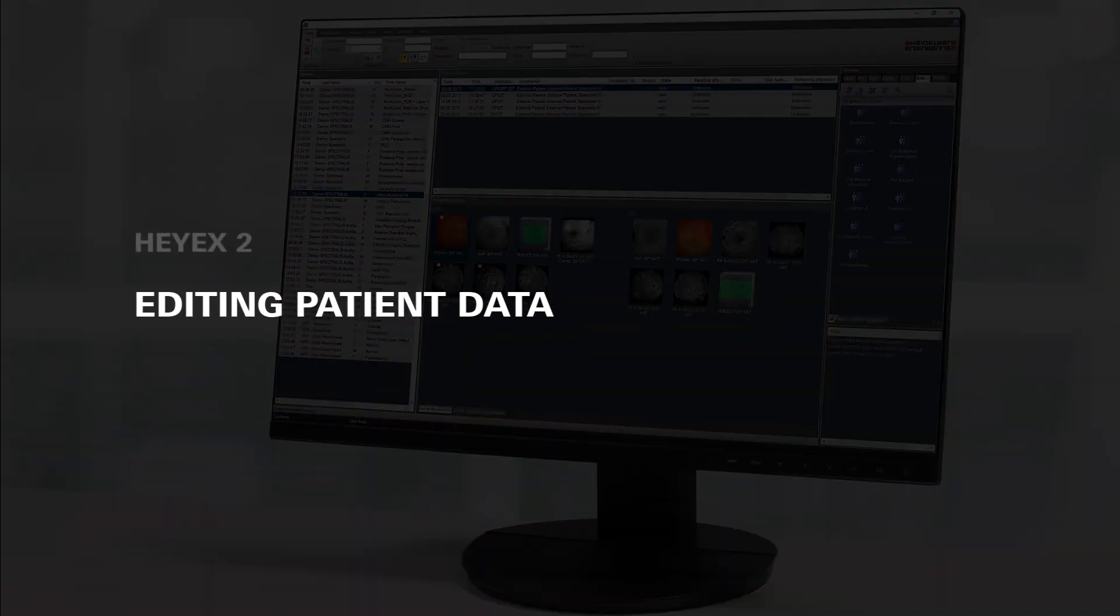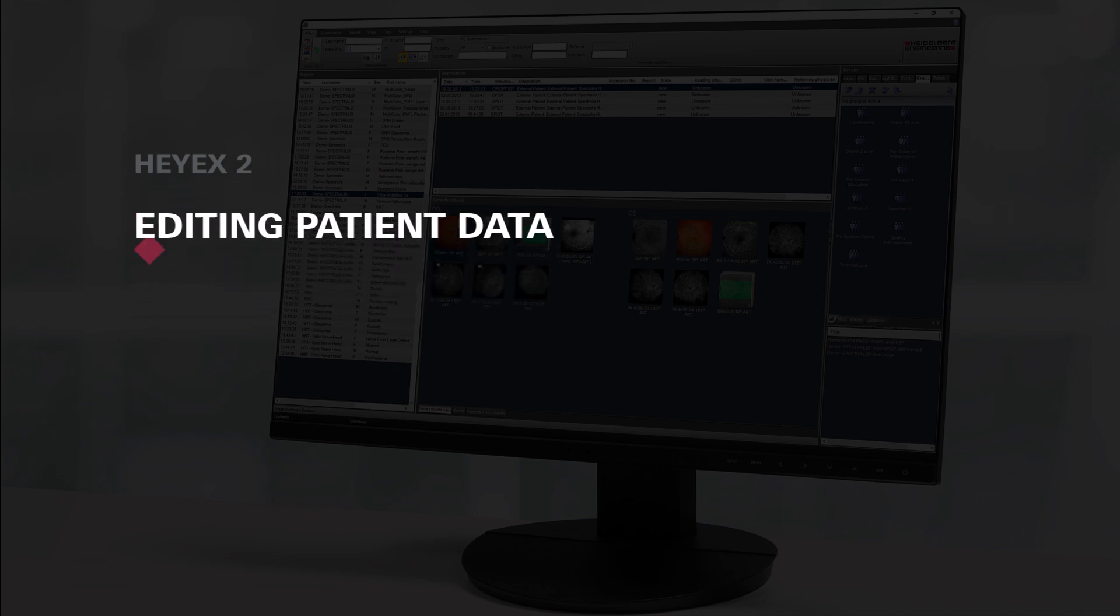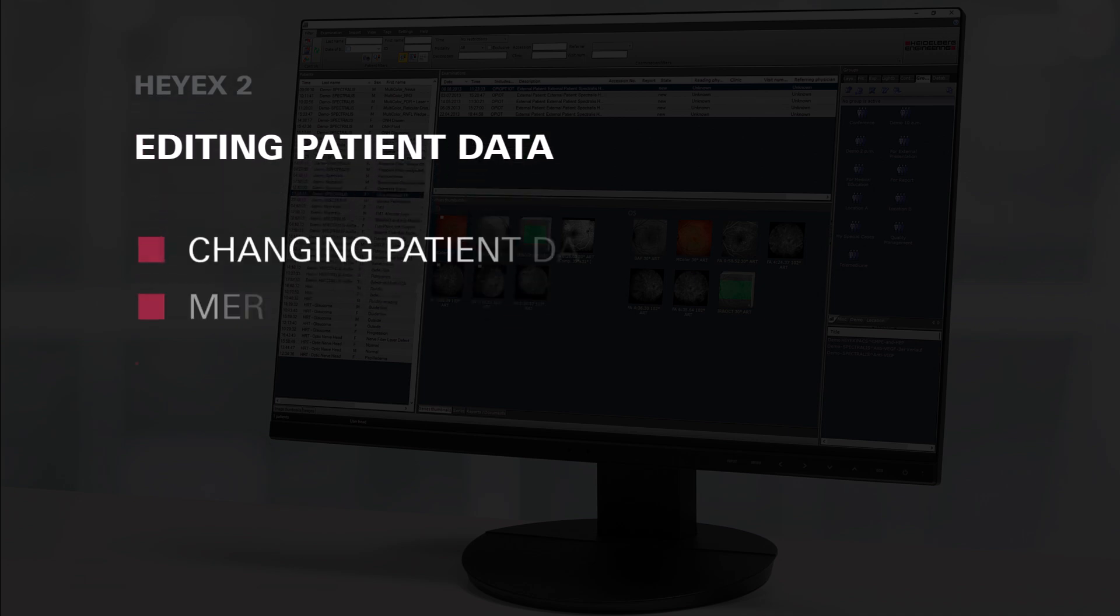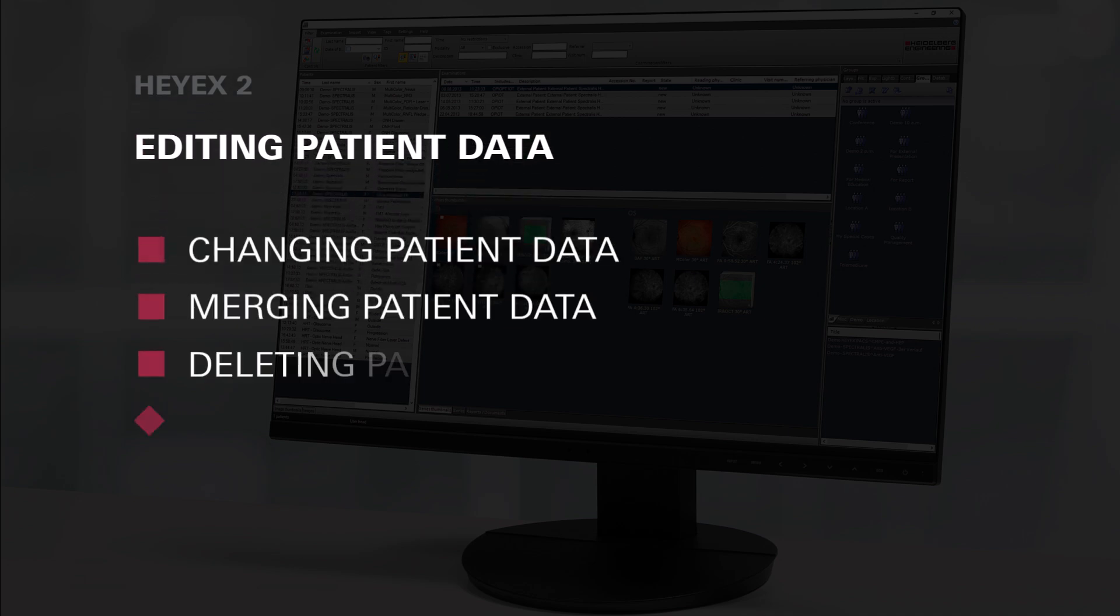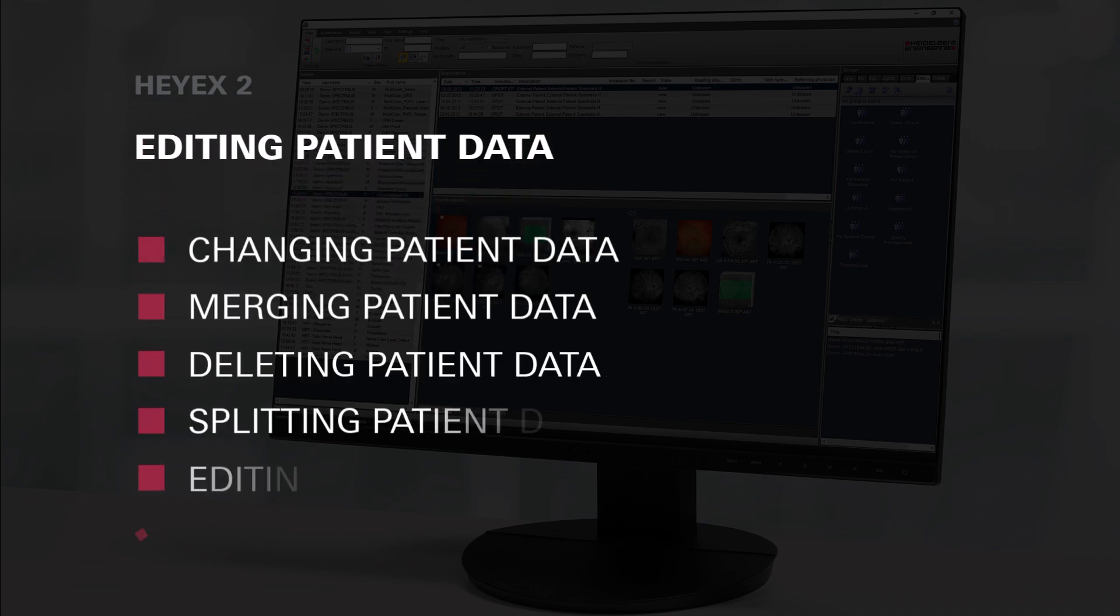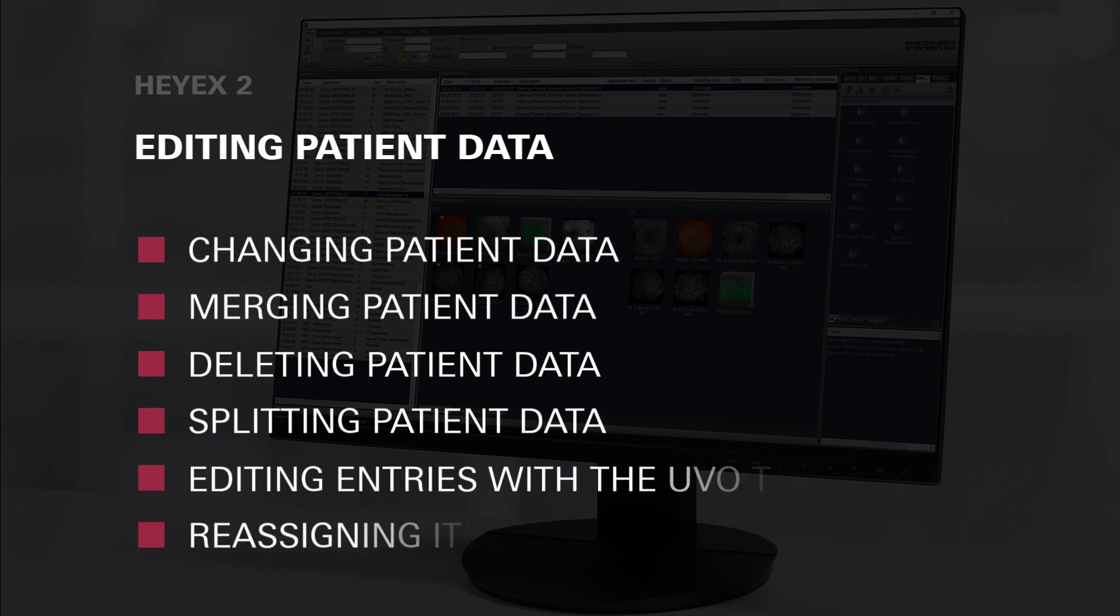In this tutorial you will learn how to edit, merge, delete, split or reassign patient data, examinations or image data in HiX2 or with the help of the UVO tool.